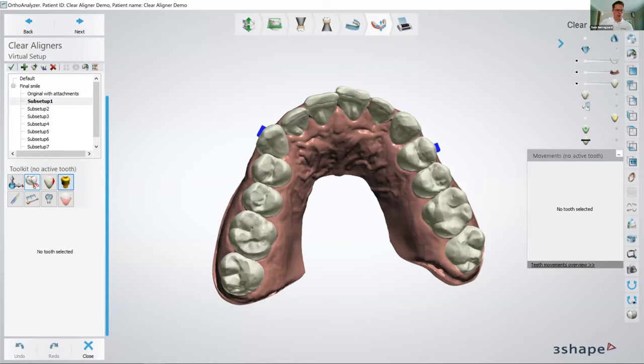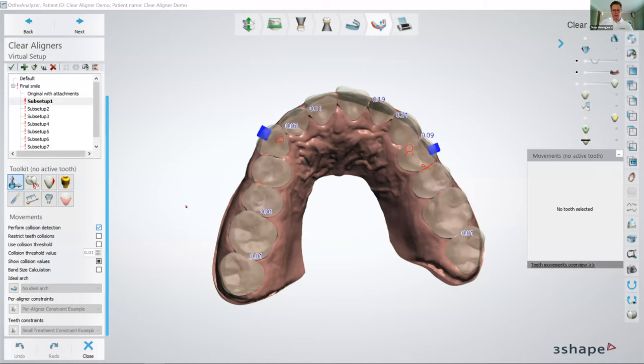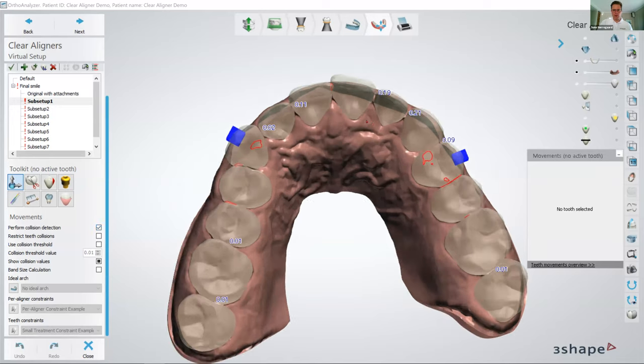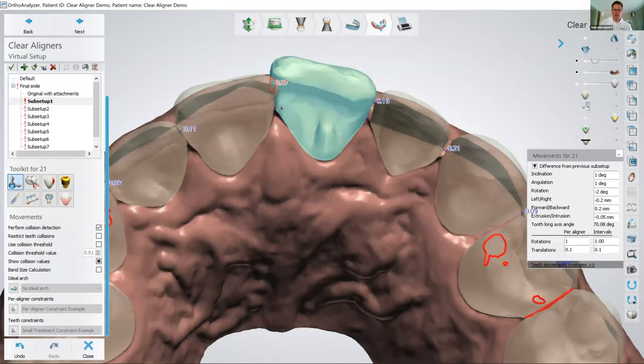What we can activate in the software is that we can have the software perform collision detection. If I activate that, it will show me the space that I have between teeth, and then it'll also show me the collisions that we have. So here we do have some collision with the neighboring teeth, but we also have some space with the other one.